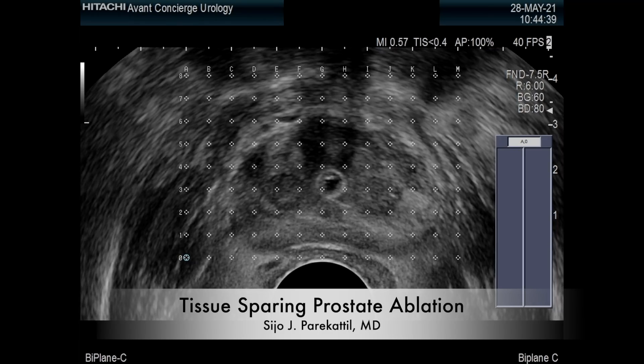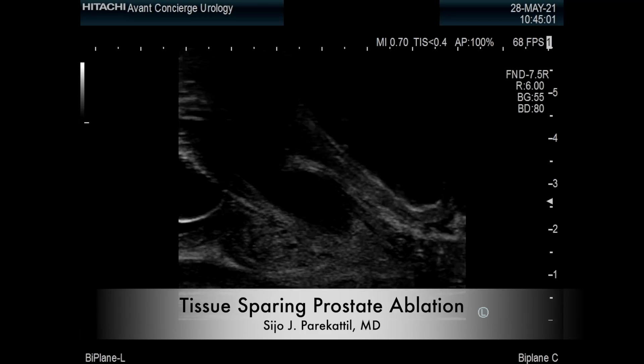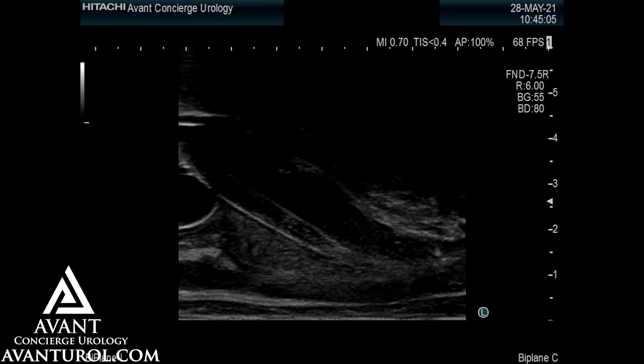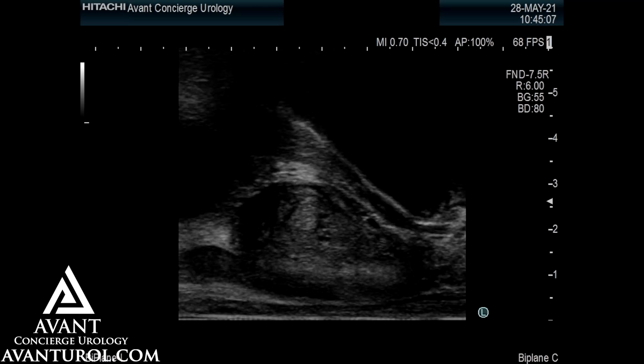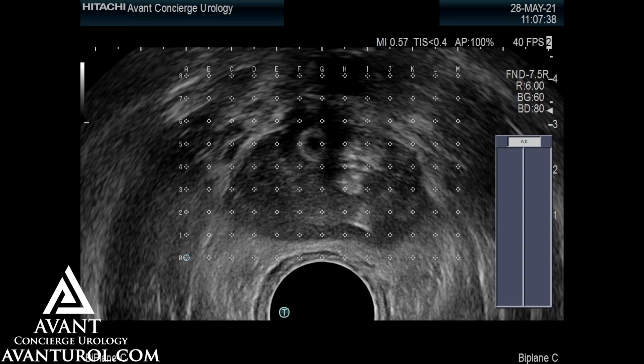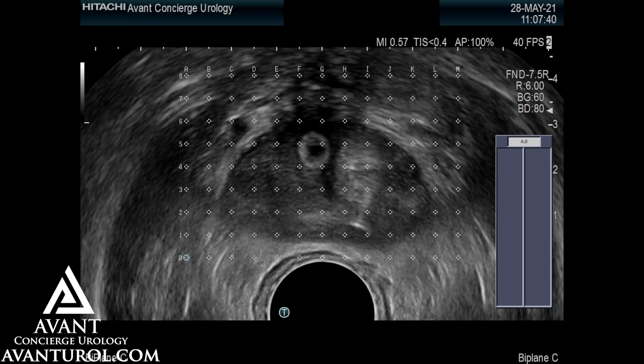This video illustrates tissue sparing prostate ablation. Initially, transrectal ultrasound is utilized to assess the prostate. A Foley catheter is placed to identify the urethra. This shows the longitudinal and transverse images used to plan the treatment.